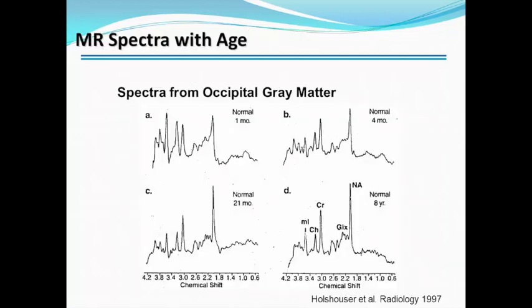Okay, but when you're quantifying these peaks, do you take the peak value of the real part, or do you integrate the peak? The real part. It's the area under the real part that corresponds to your concentration. Yeah. So you have to define the limits of that integral.